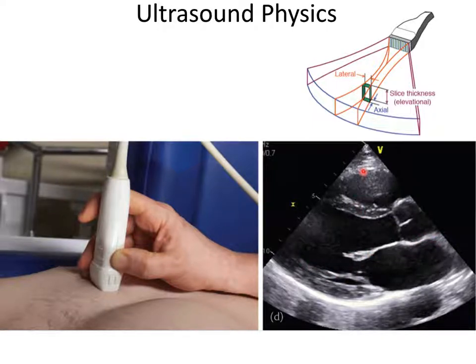And then axial resolution is the resolution in this direction. So how sharp is an edge when I draw a profile down through here? How sharp is that edge? You can see it's pretty sharp that way. This resolution depends heavily on depth. As you can see, as we go down, it gets blurred in the lateral direction.